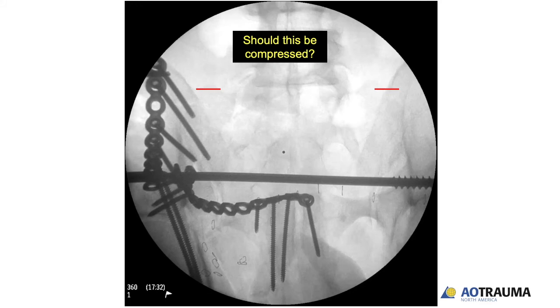I haven't gone as fancy as measuring the other side to the midline to guess my screw length. I think that's a great idea. I typically just use a very expensive clamp, which is the first screw that goes in and ends up too long, and then I change it out.